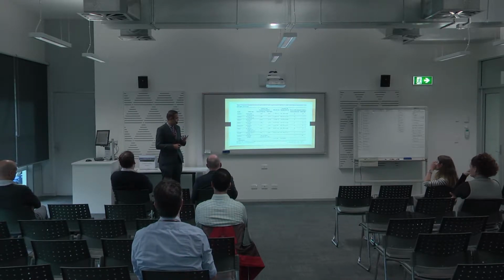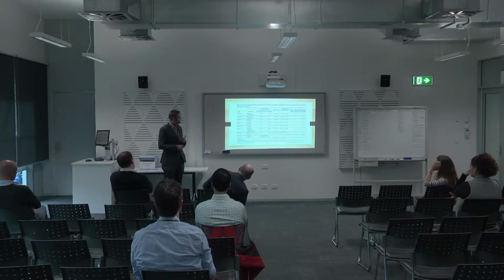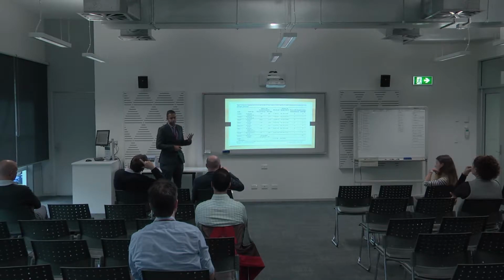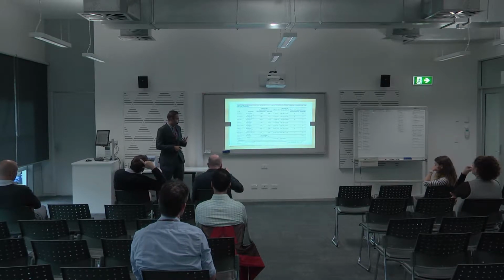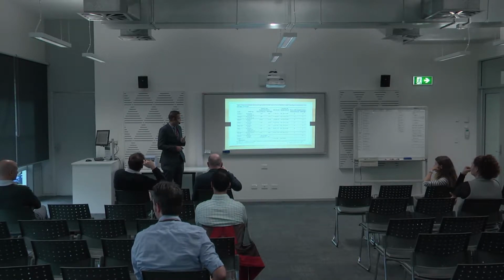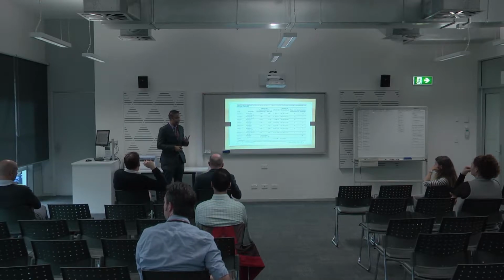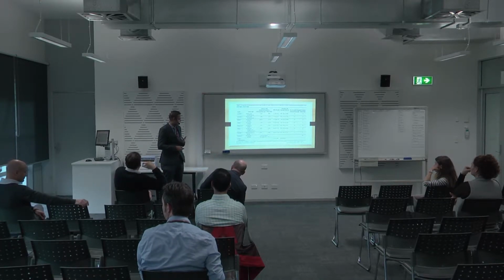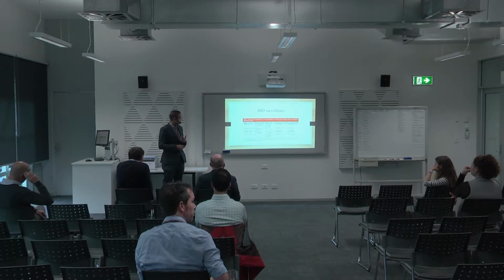Then a group of experts sat down together and ran their own meta-analysis. This was called the SCENIC group, and most of the guidelines on surveillance of IBD are now followed as per the SCENIC guidelines. Again, what they showed is that chromoendoscopy was better at picking up these dysplastic lesions for surveillance of IBD, and they did recommend using it as well.